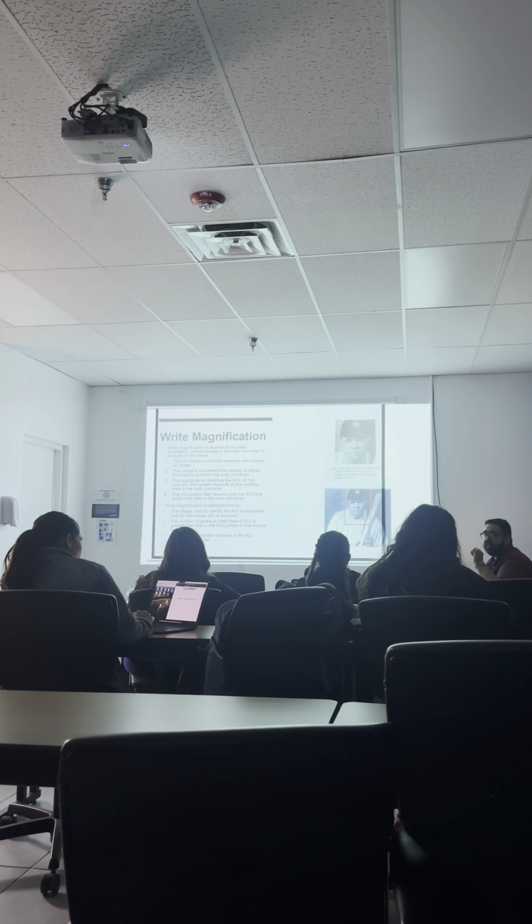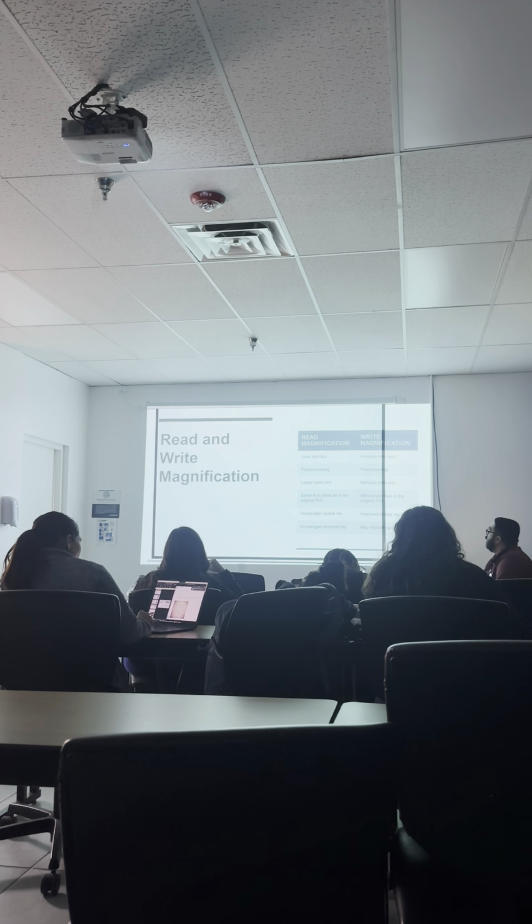I want you guys to understand that it can improve, but not always. Sometimes the image is so detailed that it needs more scan lines, and more scan lines equals more time. Okay, you need to know the differences between read and write magnifications. You need to know the characteristics.